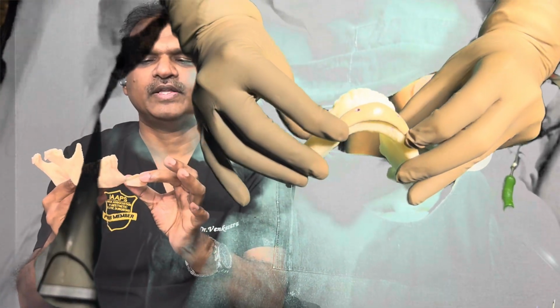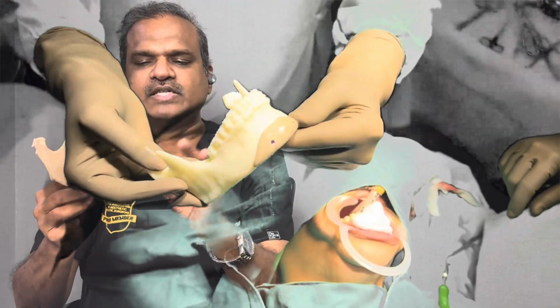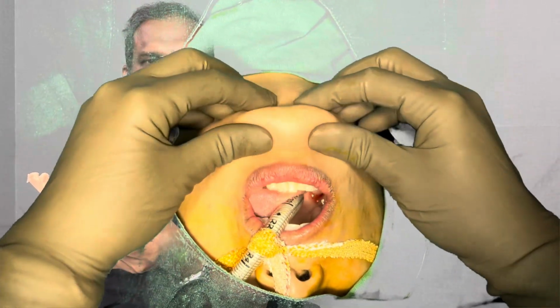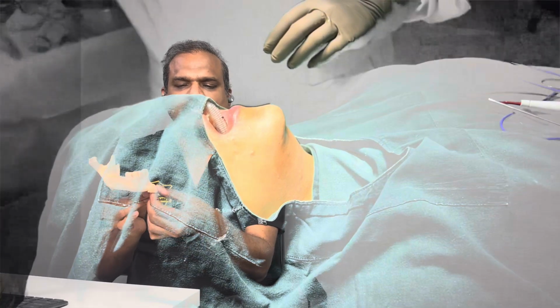With this 3D print, we can increase, decrease, we can do everything outside the operation theater before making the original implant, whichever is required to be fixed in that particular jaw. This is how we will plan a 3D printed jaw implant, and various materials are used for this. Nowadays the best is PEEK, polyether ether ketone, one of the best organic materials which we can make, and then it is fixed to the jaw.